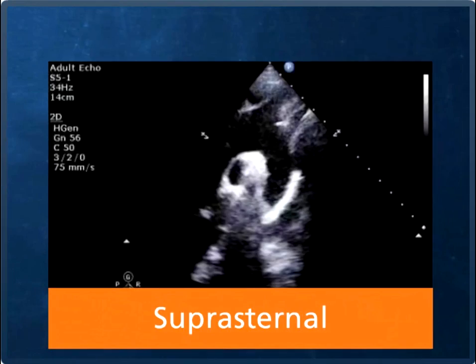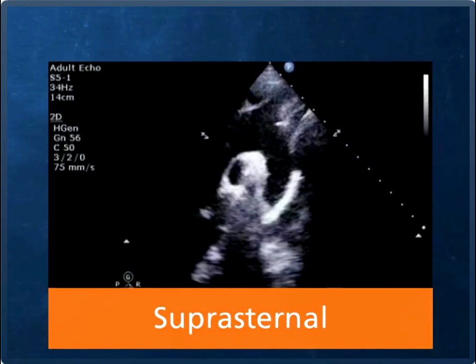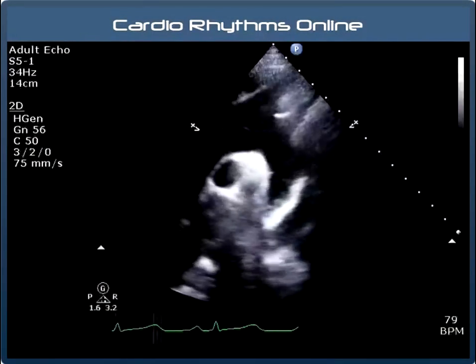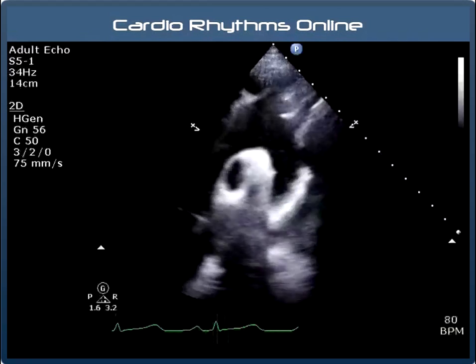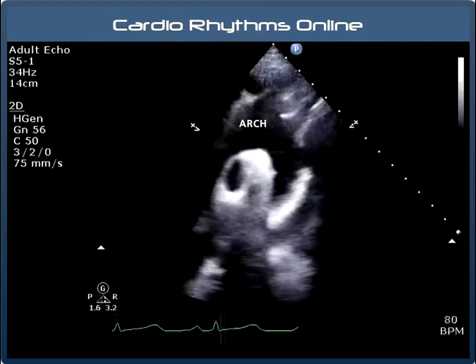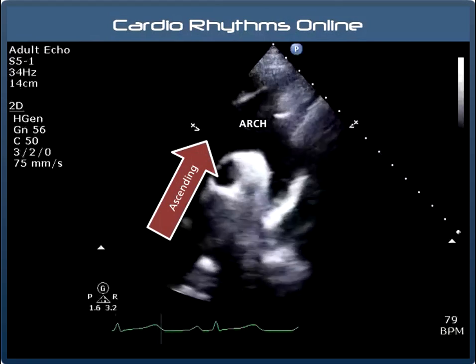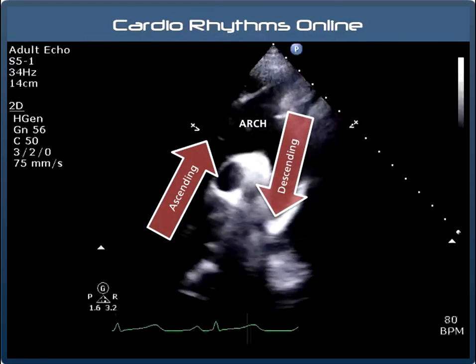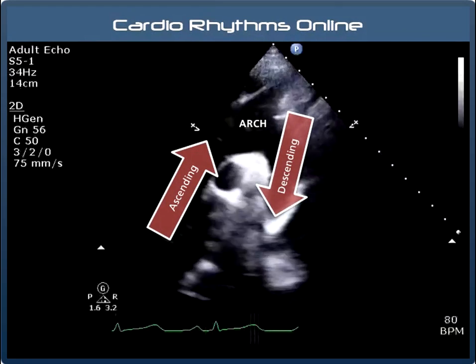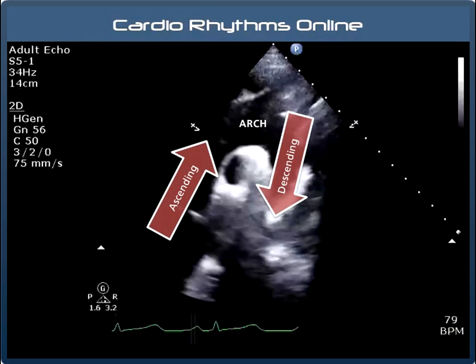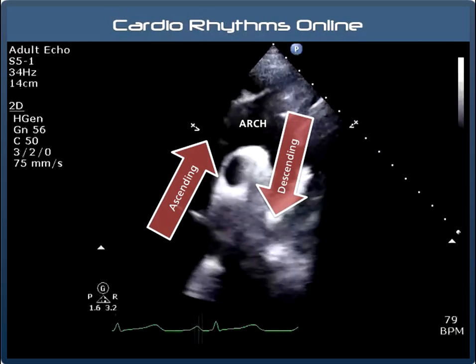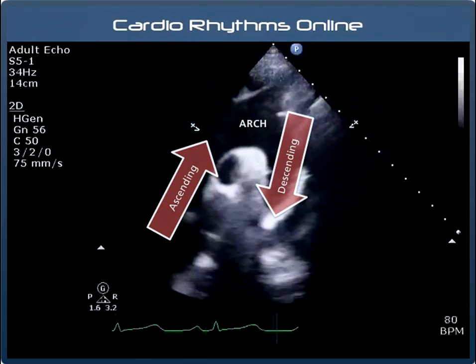Lastly we have the suprasternal view or arch view. The transducer is placed in the suprasternal notch and this gives us a view of the aortic arch. Here we have the ascending aorta and the descending aorta. We use this to assess blood flow and to check for abnormalities such as a coarctation. I have also picked up quite a few PDAs from this view.